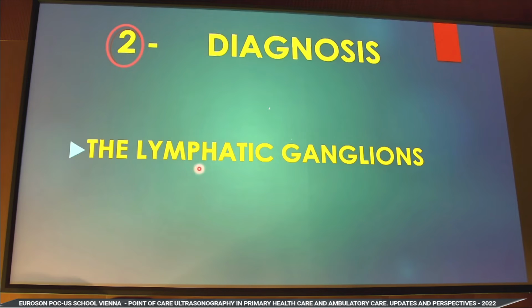So after the diagnosis of the tumor itself, now you can go to the diagnosis of the lymph nodes. I will say something very important, that I am disappointed with the lymph node analysis.